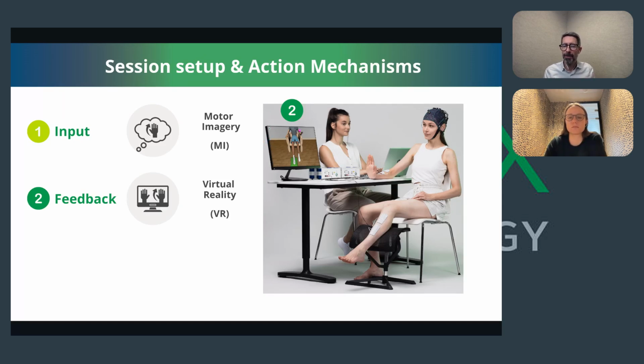Maybe you have seen those videos on YouTube where people have two arms in front of them, and then they put another one, and people tap on this arm until people actually assimilate that third arm as being their arm. So here the virtual reality is that extra arm on the screen, and it's not your own arm, because your own arm might not be moving, but if the arm on the screen is moving, we're already one step ahead in getting your own arm to move.